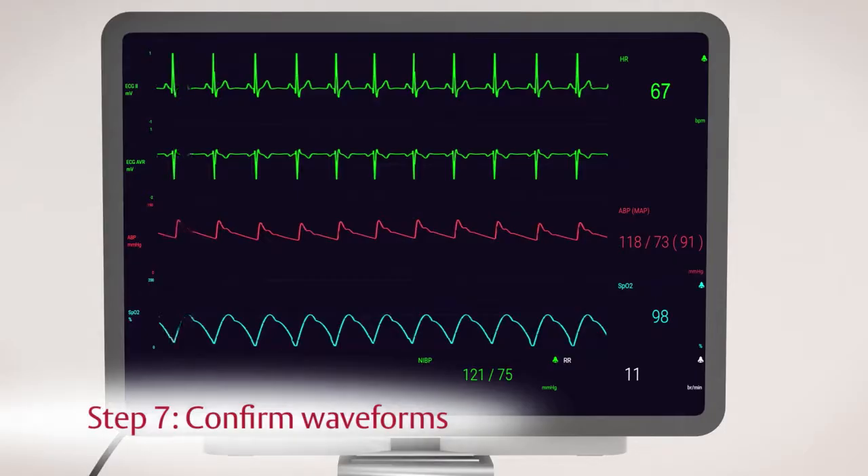Step 7. Confirm the appropriate pressure waveform and numeric values are present.